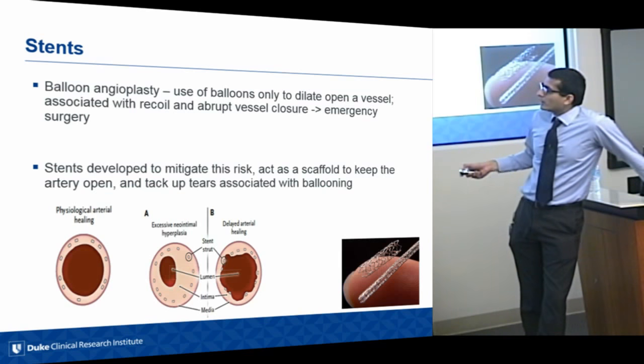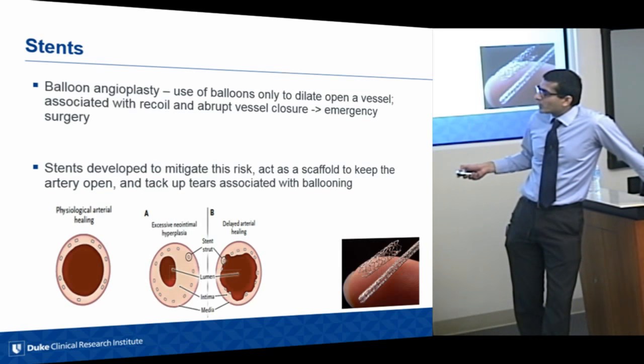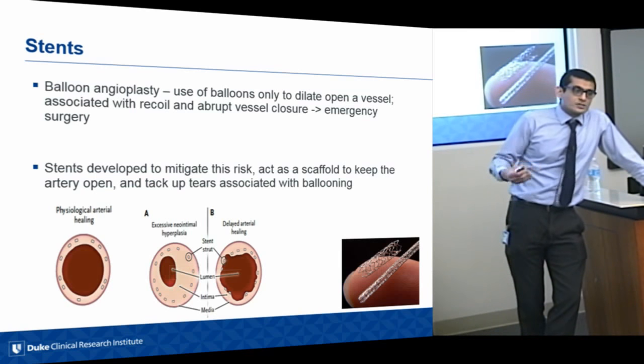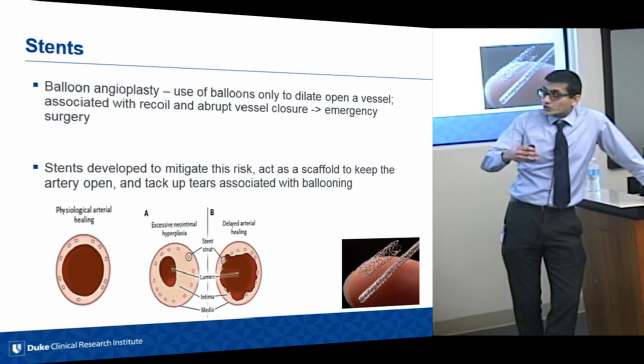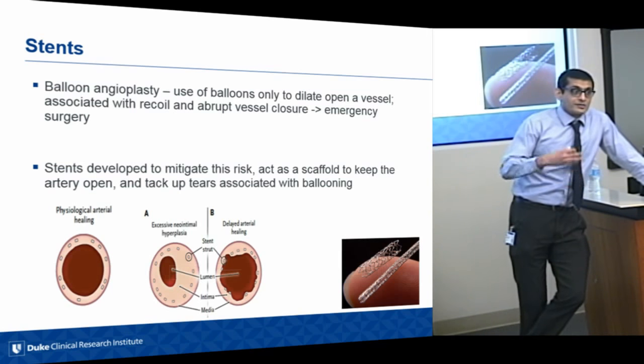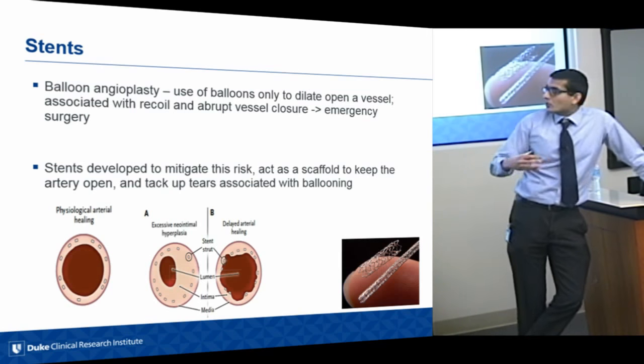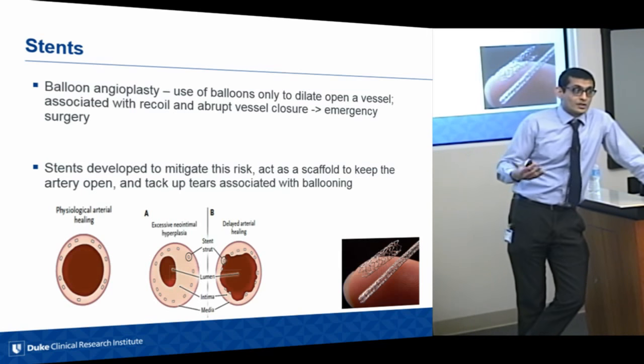Occasionally, though, the body may fail to form that skin over that stent, and stent struts are left hanging, exposed to blood. And that's not a good thing, because once we stop dual antiplatelet therapy, then the metal sticking out of the blood is a risk factor for clot formation. So the stent could easily clot off.